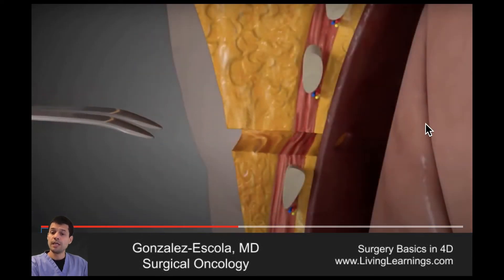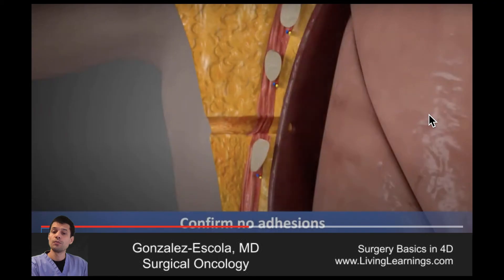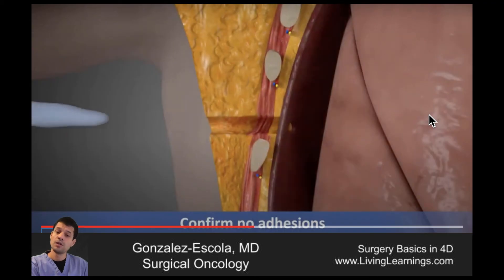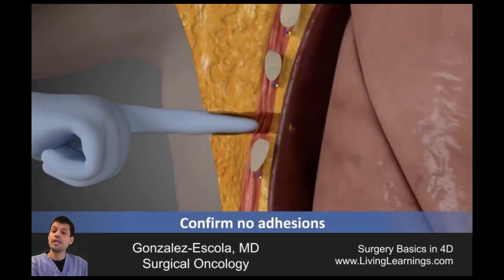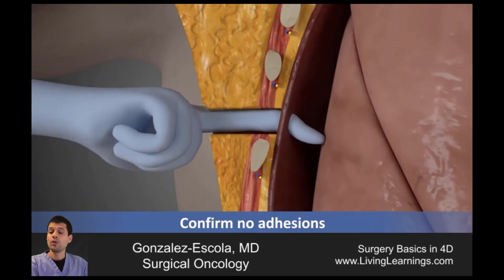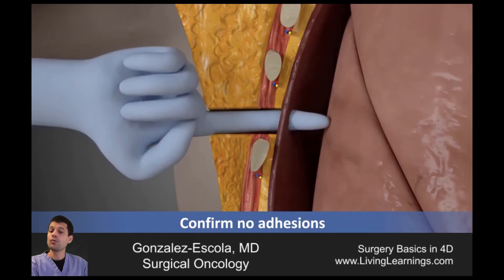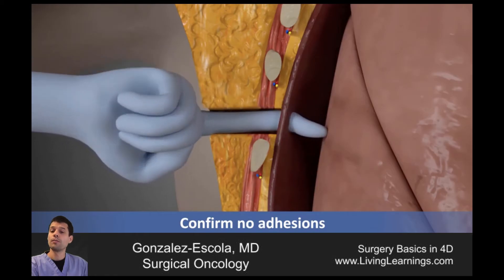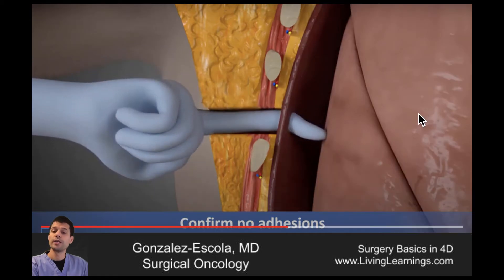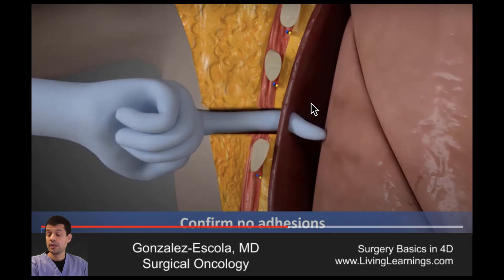Once you're in, you confirm your position using your index finger. You also move your finger up and down to make sure there are no adhesions.